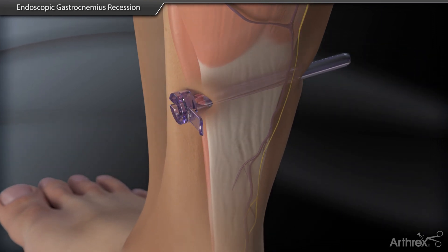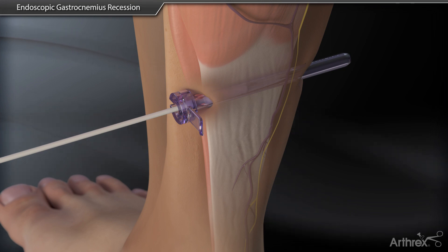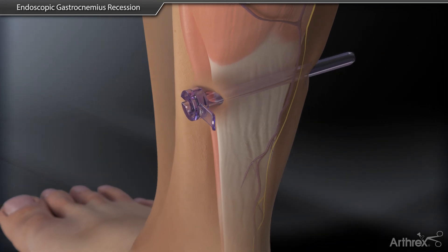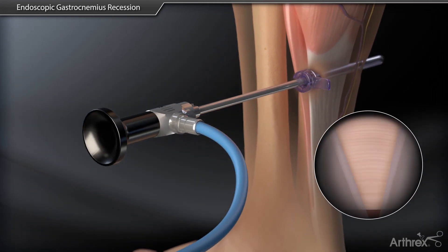The trocar is removed. Insert the sponge-tipped applicators to clear the inside of the cannula from any fluid or debris. A 4 mm arthroscope is then inserted with the camera turned towards the gastrocnemius tendon.